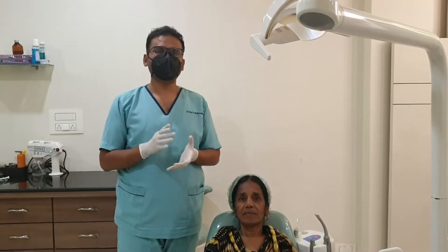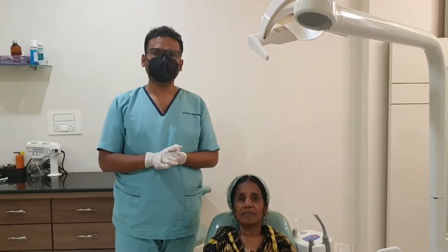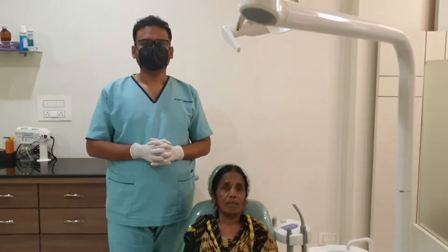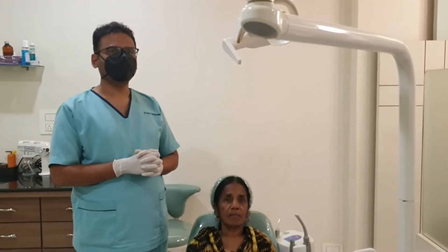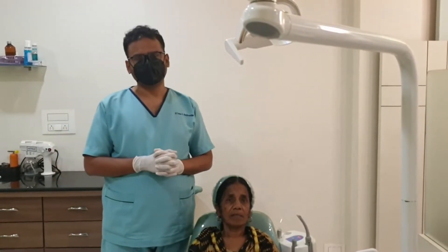Today we will be demonstrating the Inferior Alveolar Nerve Block. The indications include any procedures performed on the mandibular teeth, right from the third molar to the incisor teeth.